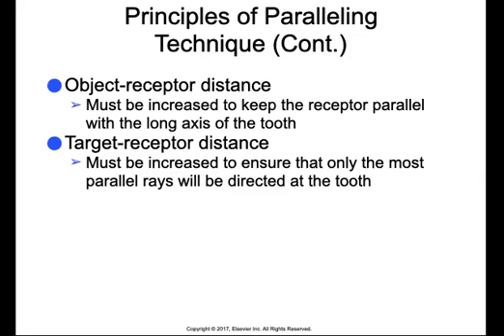Also, the target to receptor distance must be increased to ensure that only the most parallel rays will be directed at the tooth.